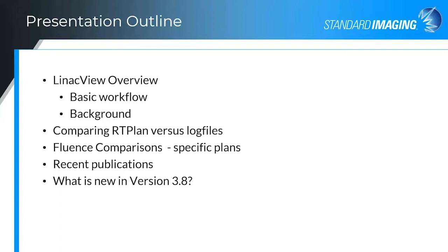Just to keep in mind, though, that IMRT-QA began to ensure that the plan being delivered matched that which was planned. One can do this using second check calculations, array measurements, and log file comparisons. Each of these methods can catch different sorts of errors, and one must be aware which second checks catch which types of errors.